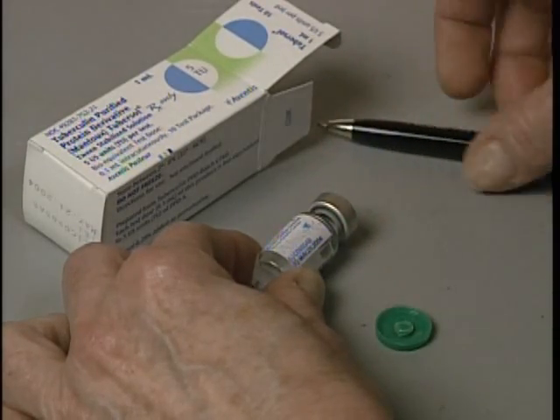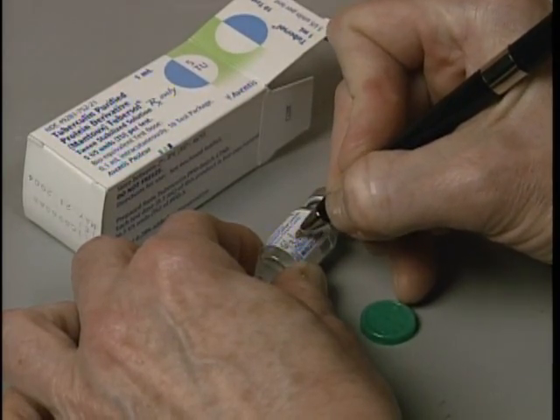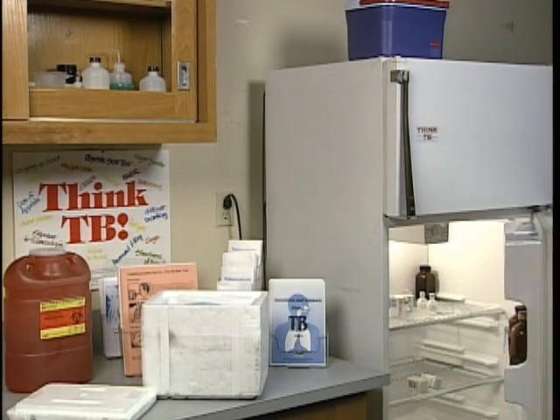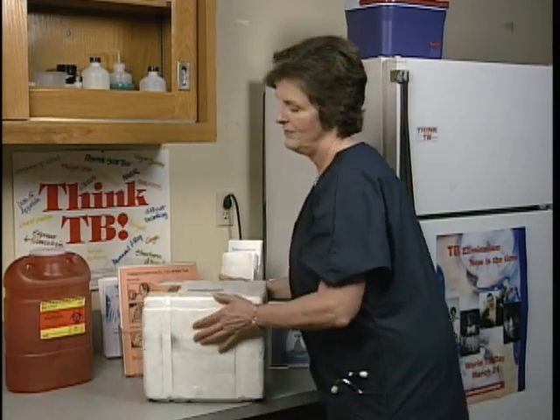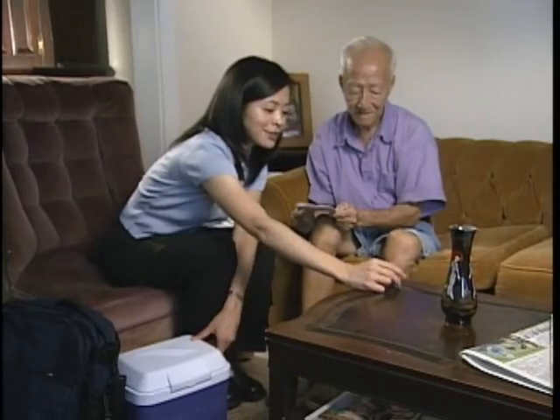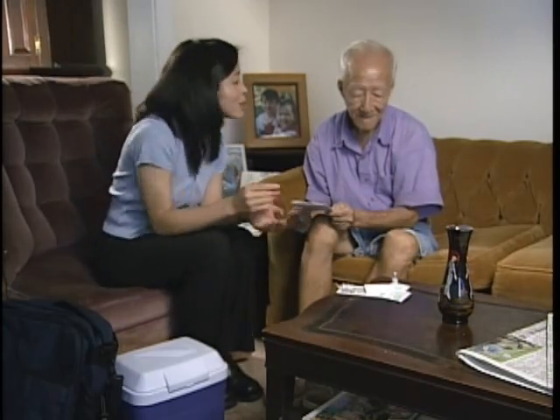When you open a new vial, write the date and your initials on the label to indicate when the vial was opened and who opened it. To avoid reducing the potency of the tuberculin, store it inside a refrigerator so that it remains between 35 to 46 degrees Fahrenheit or between 2 to 8 degrees centigrade. Also, store and transport the tuberculin in the dark as much as possible and avoid exposure to light. In certain settings, such as when you're in the field, you may need to use another type of cooling container to control the temperature and protect from light.